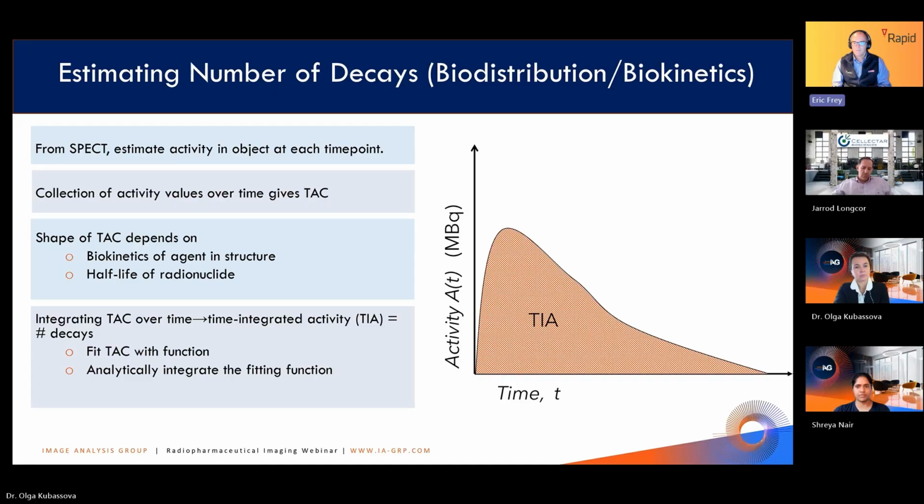So at a minimum, you'd like to have two or three time points that are distributed from this peak out, and maybe ideally one at the peak and one before the peak. So maybe four time points. Of course, physicists will always like more, but as Jared mentioned, the practical considerations about patients and the cost of doing the imaging and the difficulty for the patients argues for using a smaller number.